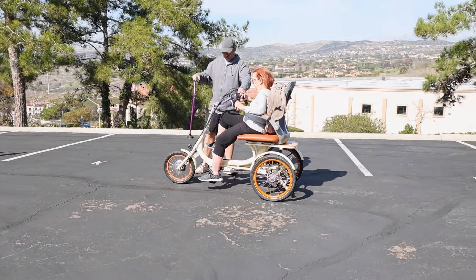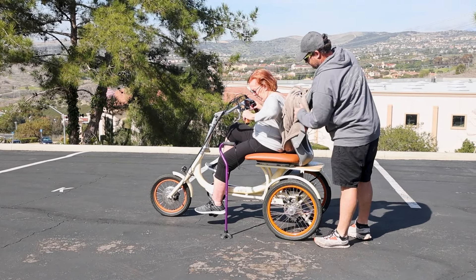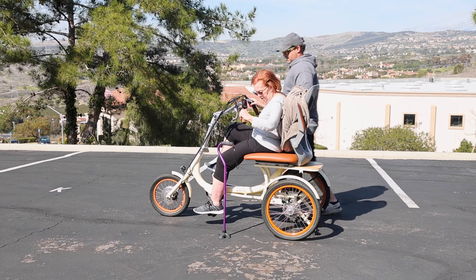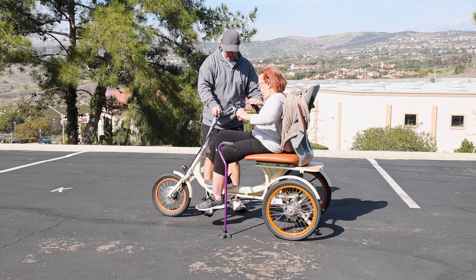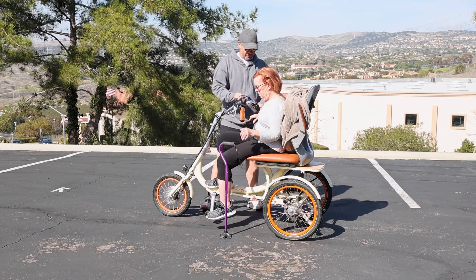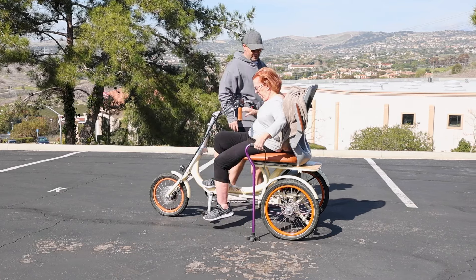To mount or dismount, you can pull the armrest up. The other option is to swing it to the side like this. We'll put the parking brake on so you can safely get on and off.